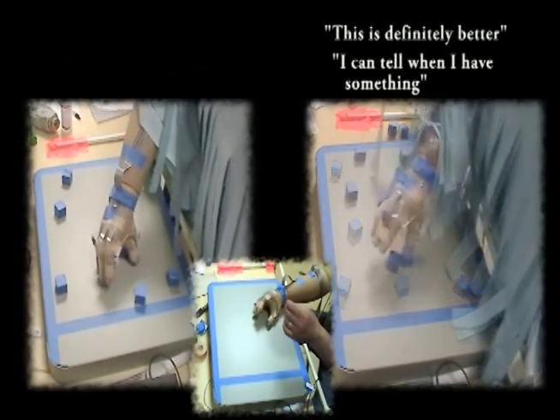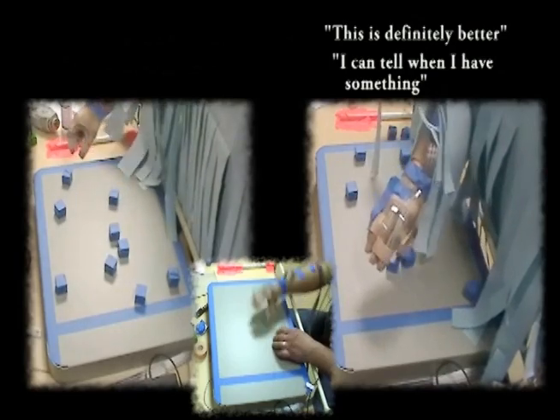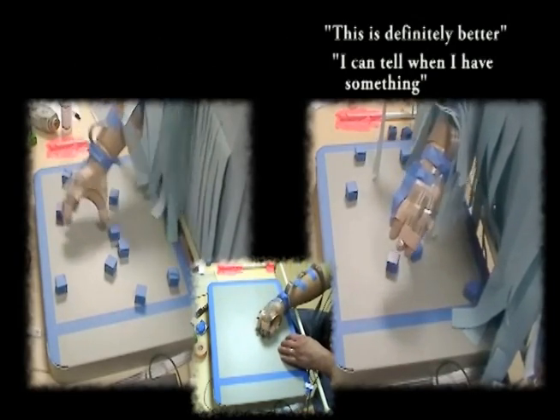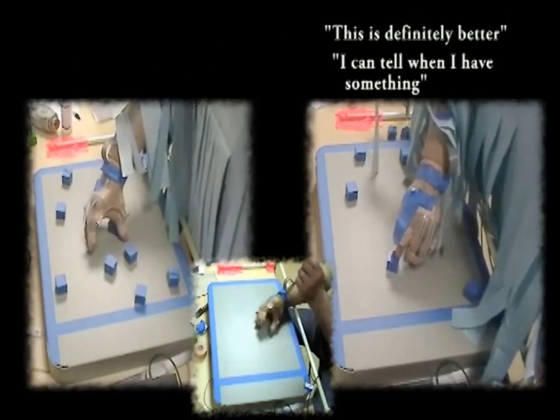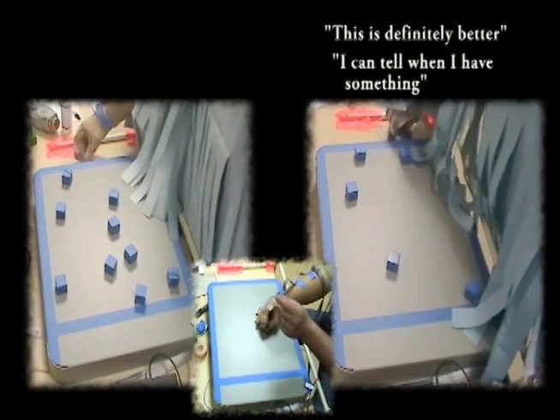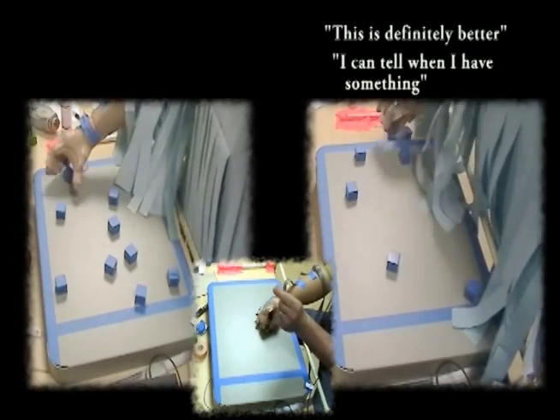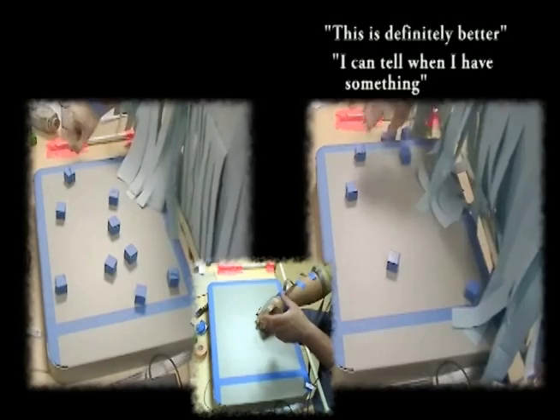This is better because I can actually tell when I had something. And then I know I can move over when I'm squeezing. Because I know the block's only that big. If it doesn't feel like I'm squeezing that much, I don't feel it. I know I don't have it. Mm-hmm. So I focused.